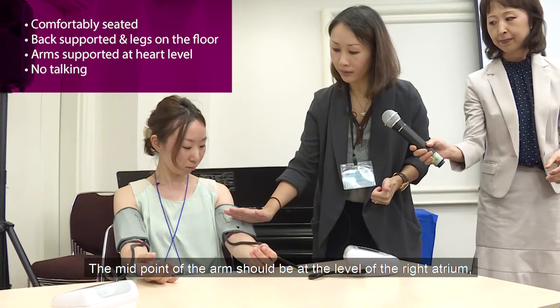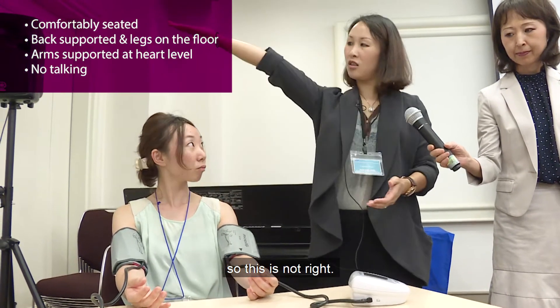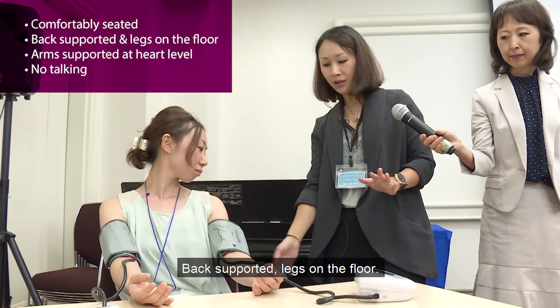The midpoint of the arm should be at the level of the right atrium. So this is not right — so this is more or less right. Comfortable. Back supported. Legs on the floor.